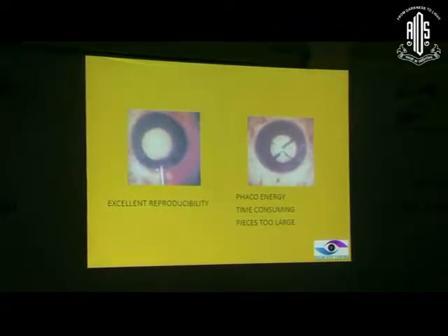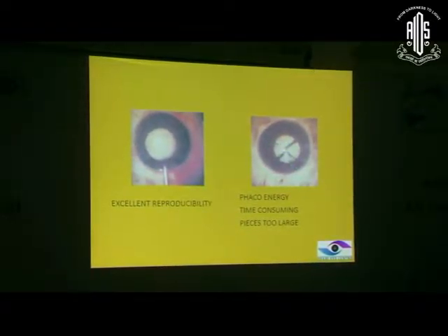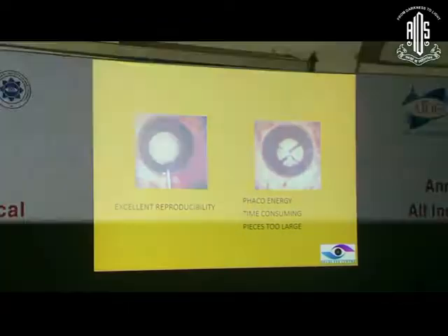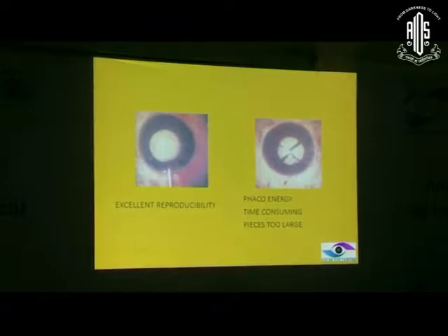The only disadvantage was that too much phaco energy was taken to trench this. Even one fourth of the piece was too large to be pulled out of the capsulorhexis margin. Many times it may tear the capsulorhexis, particularly if you make a smaller rhexis.